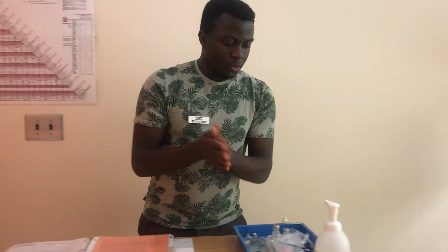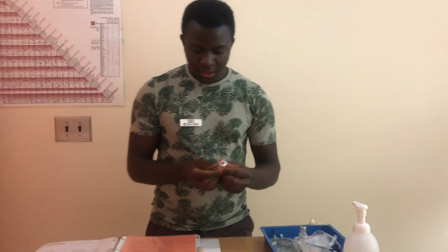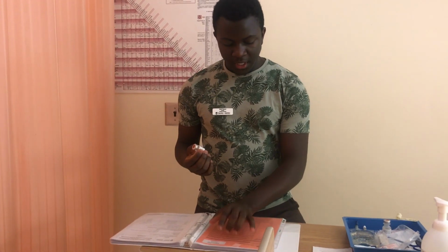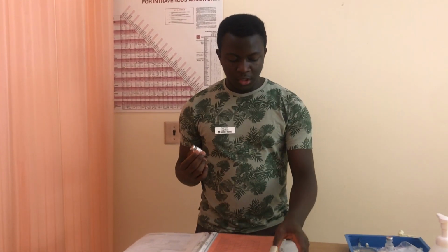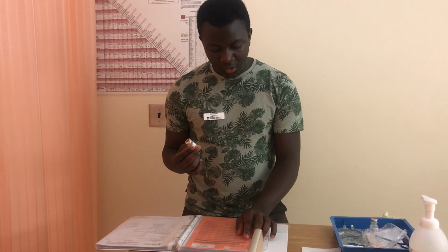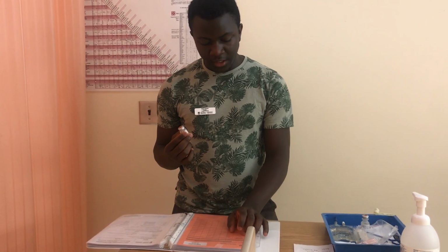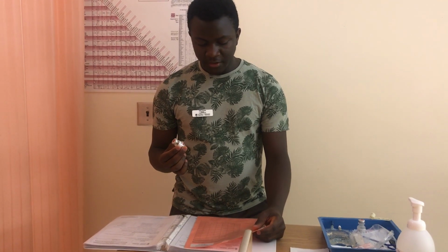Before I start, I'll wash my hands and I will grab this medication from the Pixis machine and I'll go ahead and do my first check. This medication was ordered for Whitson Emma, and this patient is allergic to morphine. This medication is methylprednisolone, so it's not a problem. The order is 75 milligrams, to be given IV, the frequency is every 6 hours, and the time would be now, which is 1400. I have done my first check and everything checked.